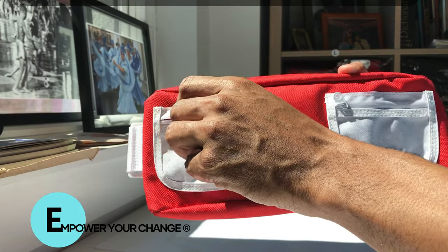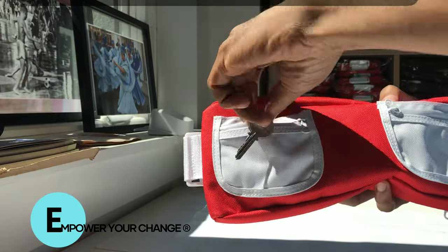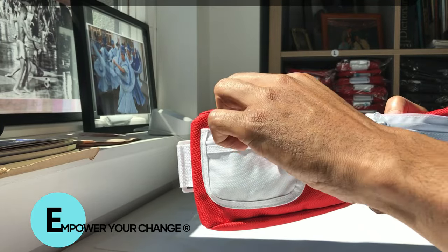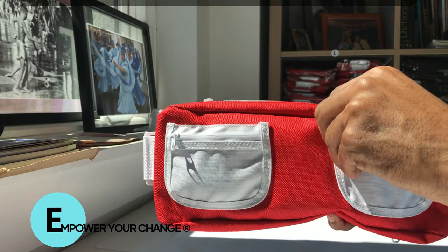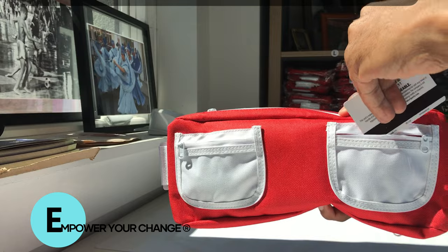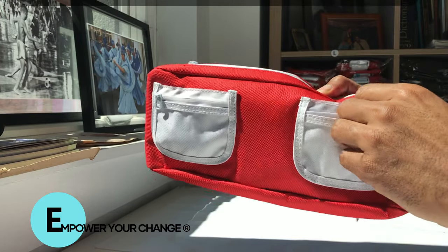You can open the pockets and place your keys if you're on the run — jogging, swimming, biking, any type of active use. Put your keys in one slot; on the other side you can put your credit cards and your ID right in the slot and you're good to go.